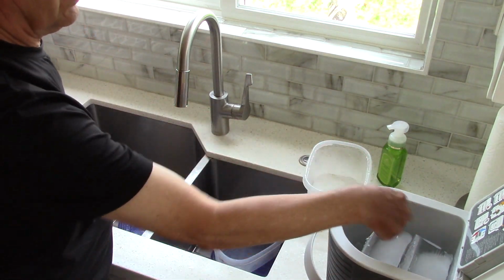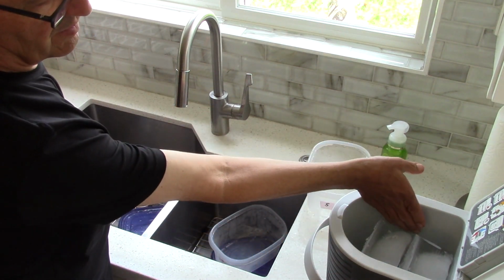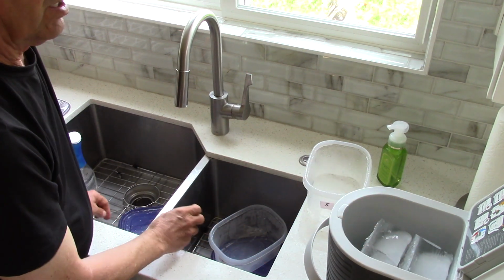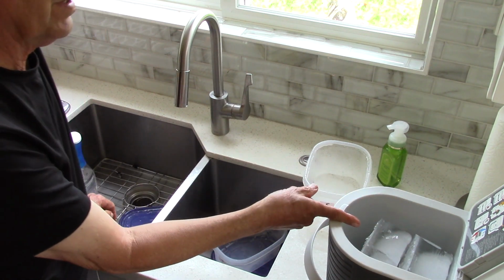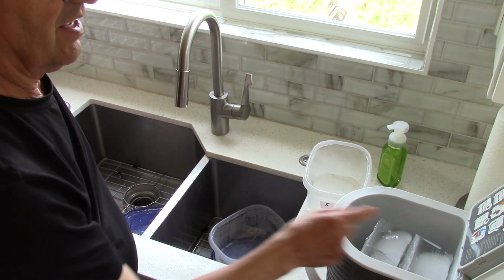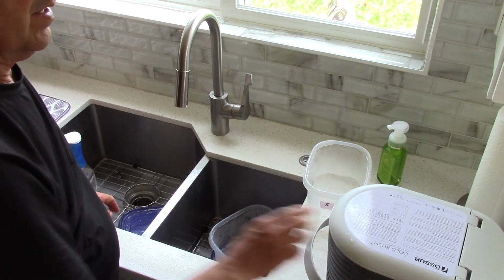And you can see I have the water up to about right here. You can fill this up with ice cubes if you'd like to. You might get a little bit more time. You're good for about 4 hours with this, depending on the speed setting that you put it on. There, you're ready to go.